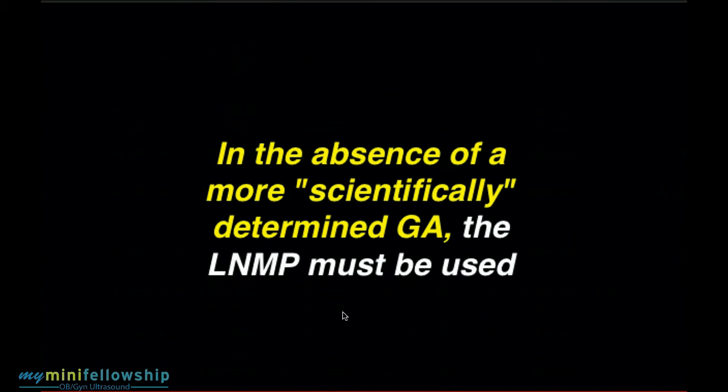Measurements of the fetal biometry prior to the 20th week of pregnancy. Those are uniformly believed to be more accurate than patient dates. I'm not saying that an obstetrician will invariably change the dates if those measurements do not match the patient's last menstrual period dates, but these are scientifically valid means of determining gestational age.